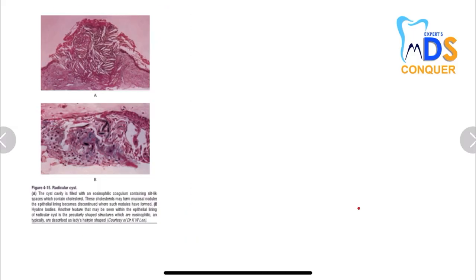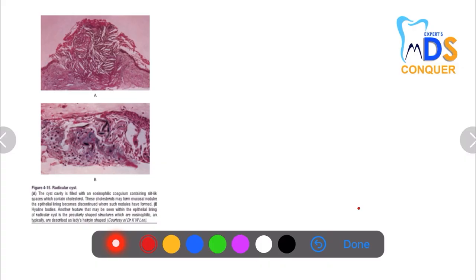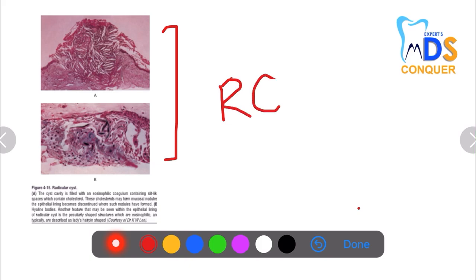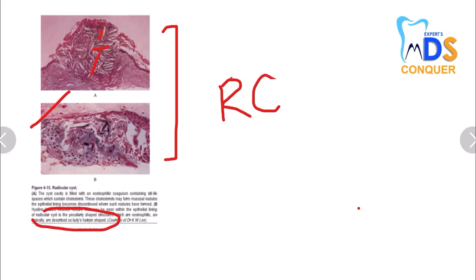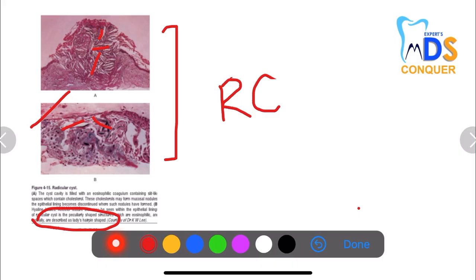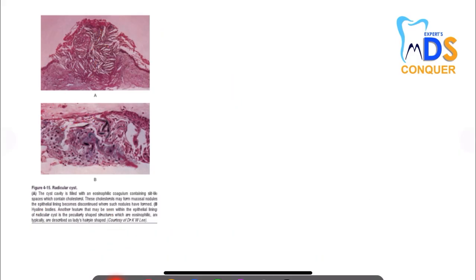Next — very important, and one you may have missed — is the histological picture of the radicular (periapical) cyst. The cyst is filled with an eosinophilic coagulum containing slit-like spaces which contain cholesterol. There are also peculiar eosinophilic structures described as ladies' hairpin-shaped. These slit-like cholesterol spaces and ladies' hairpin-shaped structures are unique features of the radicular cyst — do note them.